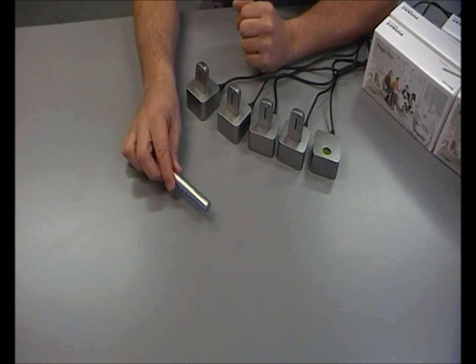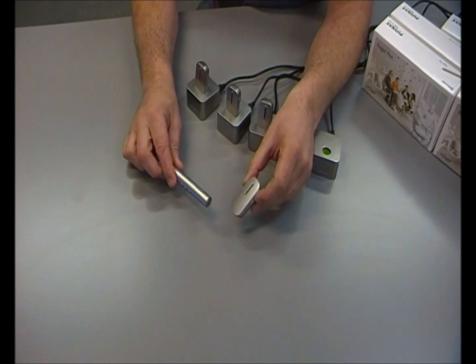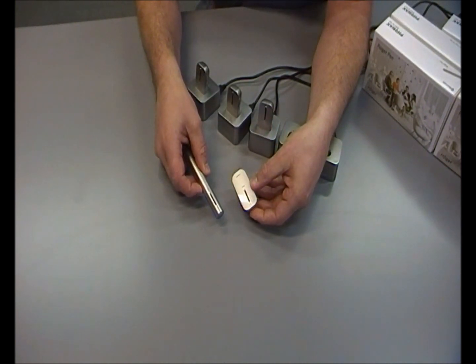I take the Roger pen and to set up the network, I take my first clip-on microphone. I turn the clip-on microphone on by pressing and holding the on button. And once it's on, all I do is hold my Roger pen beside the clip-on mic and press the connect button. A green light indicator on both units confirms that it's been added to the network.